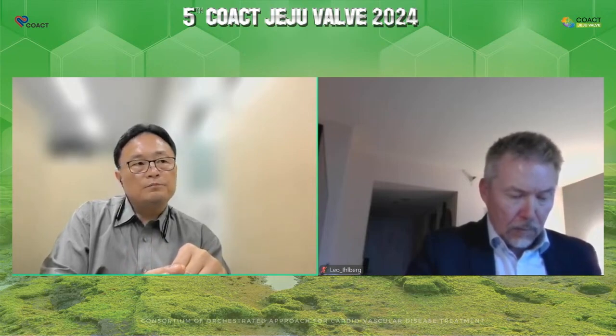And as you said, the post-dilatation method may cause a problem in the future on the valve durability, but this is a trade-off between leaving more than mild to moderate PVL and thinking about the long-term valve durability.